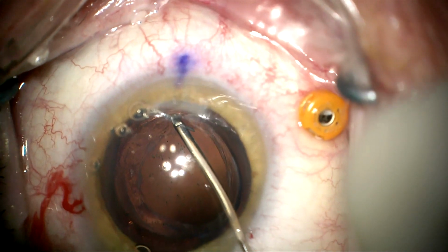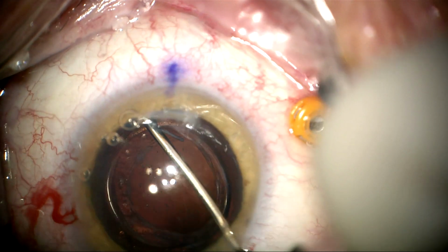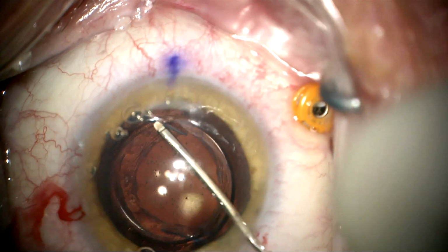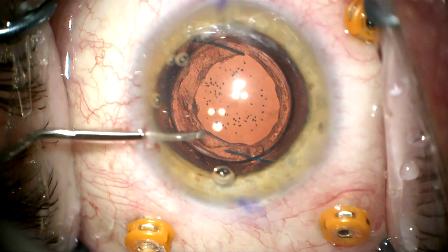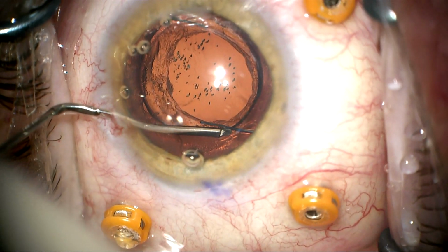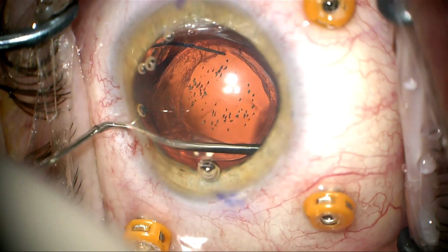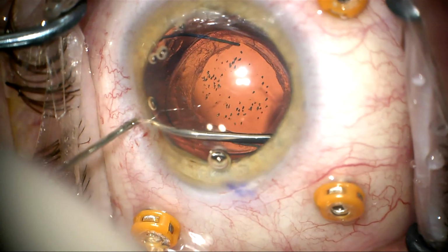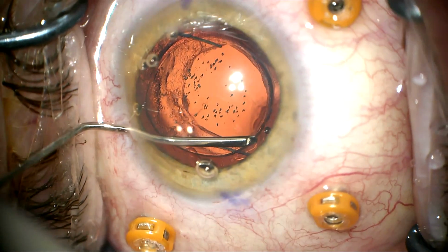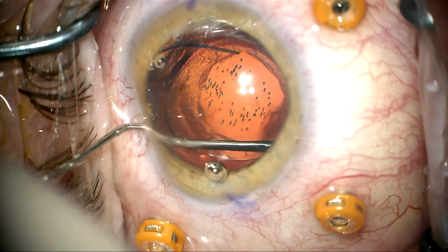The haptics are in the capsular bag, but the anterior capsule rim is fused to the posterior capsule, and it's very hard to separate the anterior from the posterior capsule because of this fusion. So here we're going to try to enter with a LASIK cannula right where the haptic is entering into the capsular remnant, and try to see if we can get this opened up.